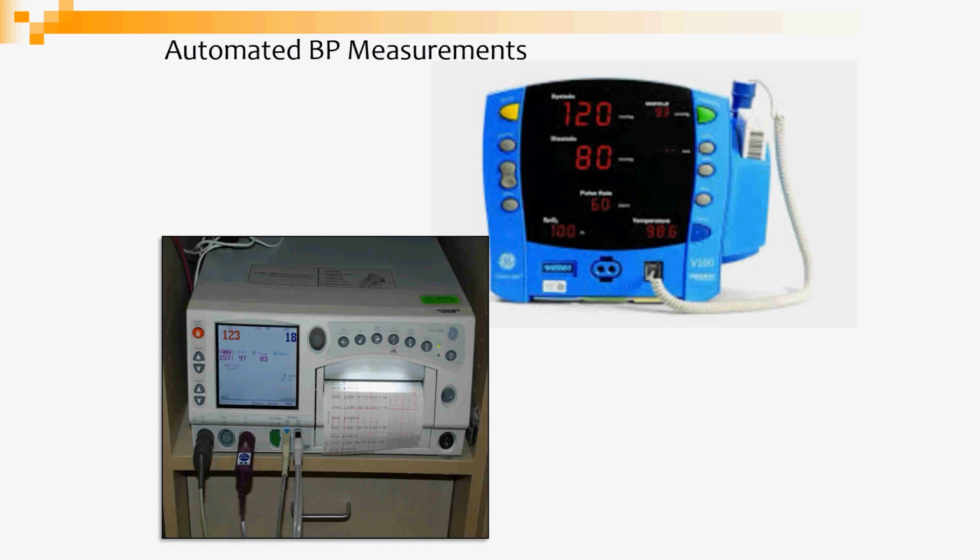So these are perhaps two of the ones that we're most familiar with. It really is important to make sure that your machines, whether you're using a Dynamap, such as the blue one in the right-hand corner, or it's part of the fetal monitor, that regardless of what type, what model or make, it's regularly checked and calibrated by your biomedical department. Make sure that there is no abnormality in the readings and that it's correctly calibrating. Next slide.